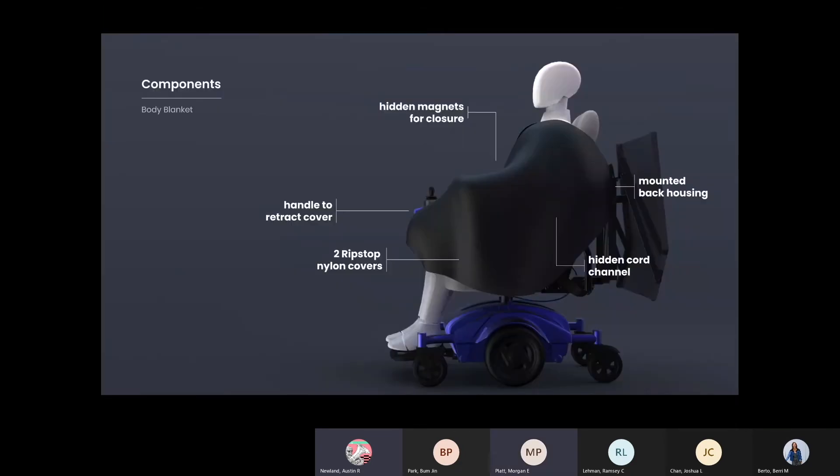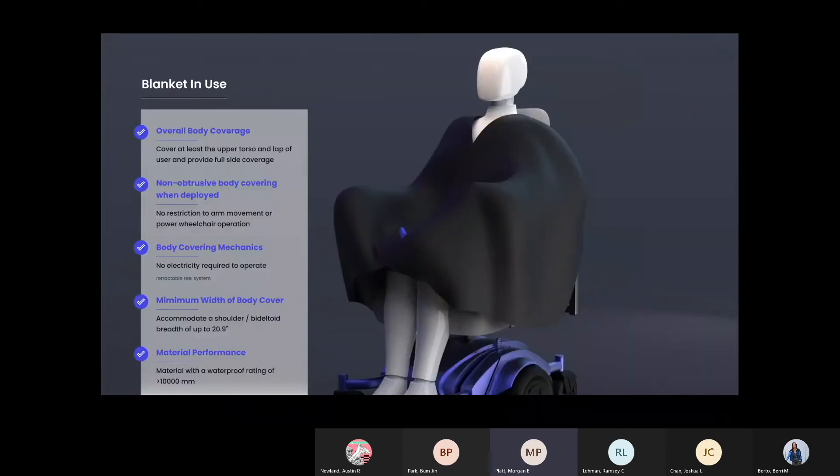Now we get into the details of the body cover. Overall components are shown here. It has two fabric covers that connect in front of the body with magnets. The cover has a handle that connects to a hidden cord channel, which is attached to a retractable pulley system on the back of the chair. This allows the cover to expand and bunch up to store.